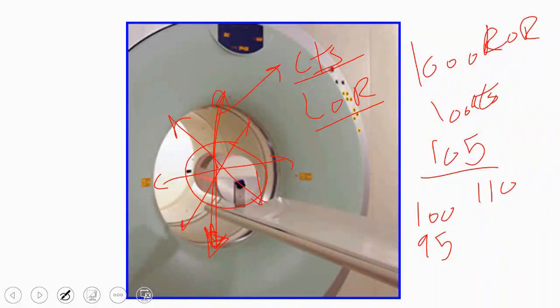What does that mean? Pay attention. These different numbers will affect what, doctor? The detection efficiency has become different at different angles, right? When you come to image a patient, each detector will have different detection sensitivity, right? Is this clear so far? So you want to unify the detection efficiency. So you create a correction factor. How do you do that?